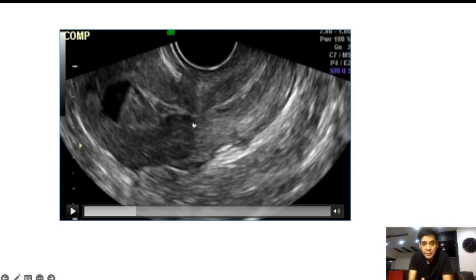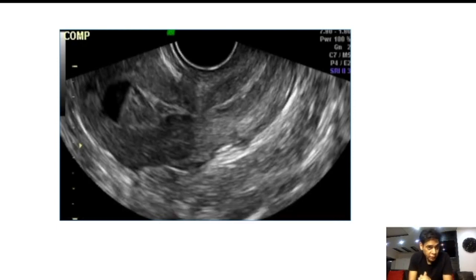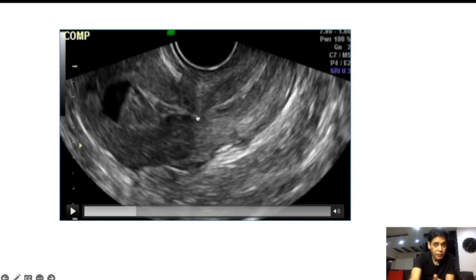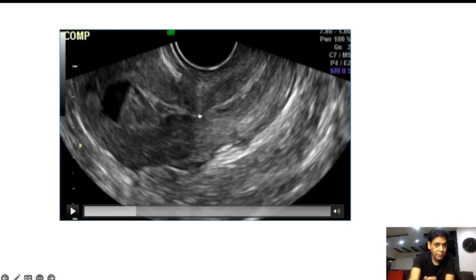Now, what is the diagnosis here? One thing is clear: there is fluid collection with internal echoes, probably blood collection. The second thing we are coming up to is that this is likely due to a contraction or narrowing at this level. And the third thing is that this contraction or narrowing has some relation with this area.